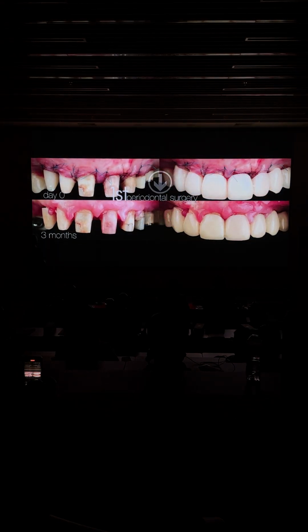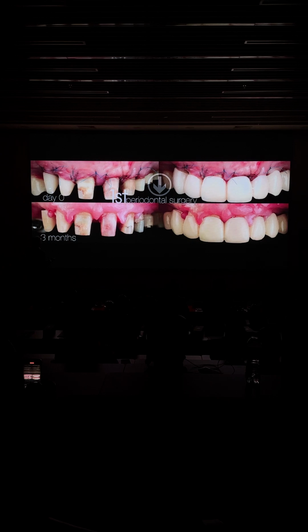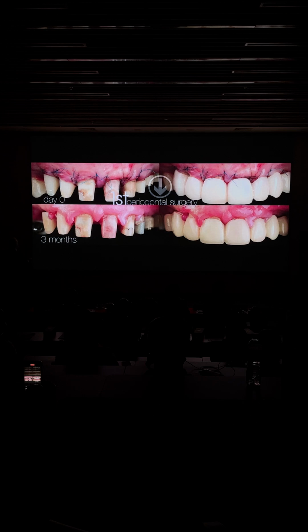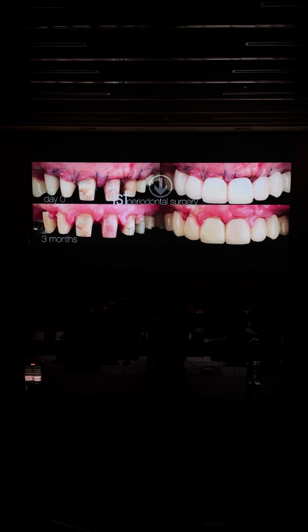So this is the first surgery. You can see that in the first surgery, the papillas were cut here. Around the implants, I didn't elevate the papillas. I didn't cut my papilla in between the 2 centrals because I have no more here. And I grafted full tuberosity in between the 2 central incisors.